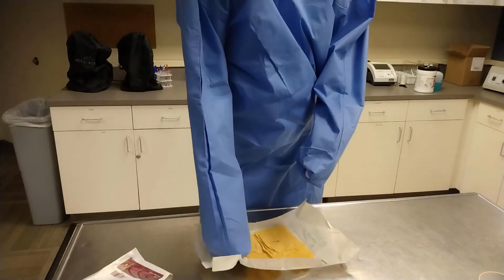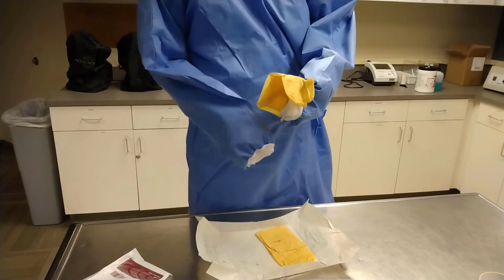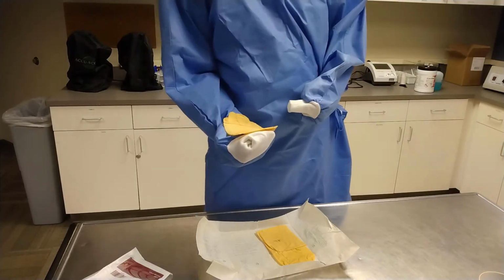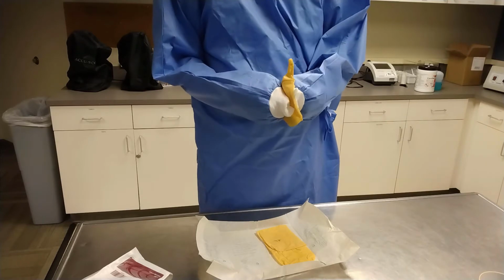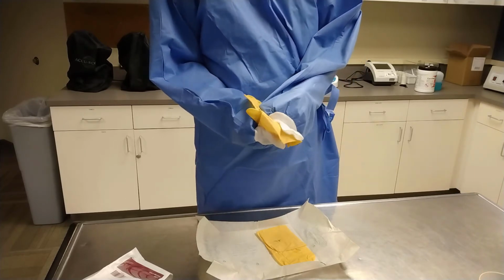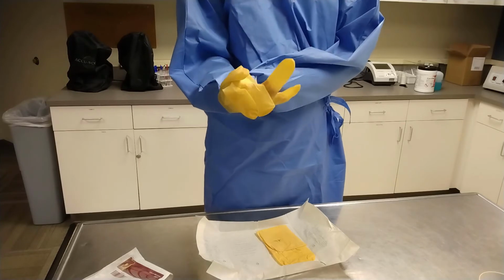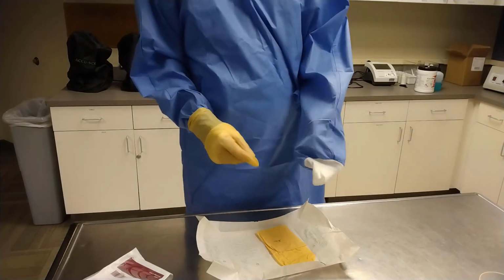So what you want to do is, one way to do this anyway, if you can get the glove on, just grabbing the cuff and pulling it over, you can. But one trick is to put it on your hand facing you, like that, with the thumb on the side that your thumb is on. So my thumb's out to the right, thumb's on the right side, and then you can grab one side of the cuff with this hand, and then you can grab the other side with this hand and pull it over, like that. Right? Then you can work your hand up into there. Like that. And then the other side is a little bit easier.